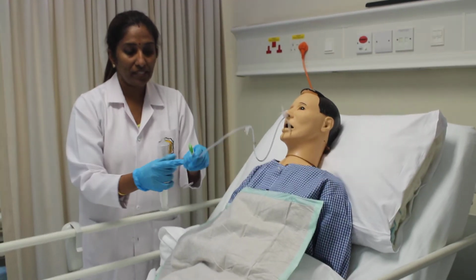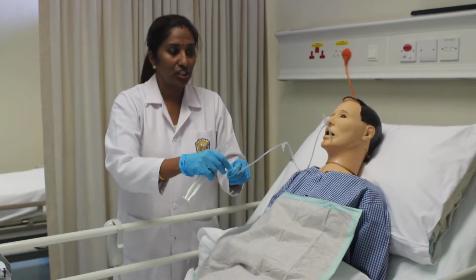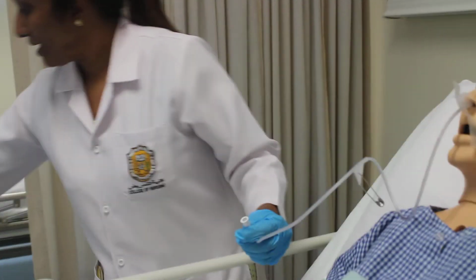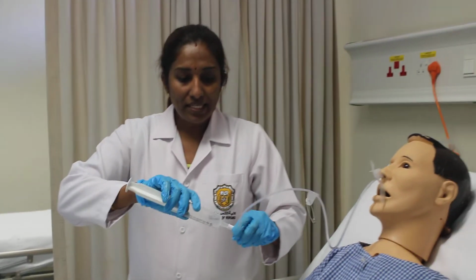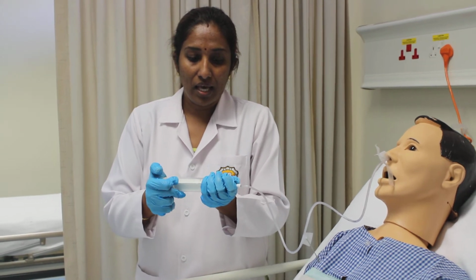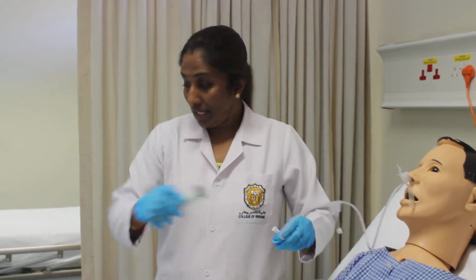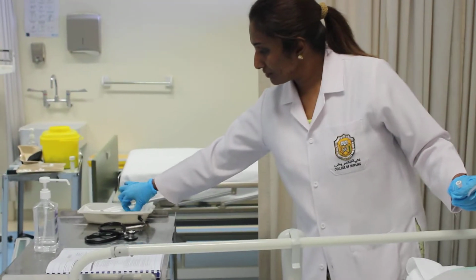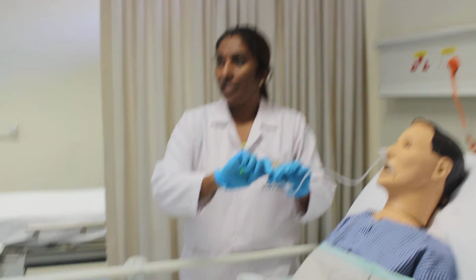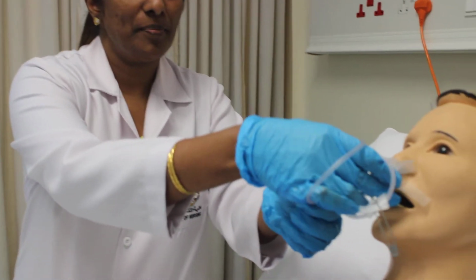You will be pinching the tube, same like during insertion and feeding, where we were pinching the tube to avoid the entry of air. So you have to remove the cap and then instill the air so that the tube is cleared completely of any fluid. And then you will be coiling the tube in your hand, so that no fluid is spilled anywhere.